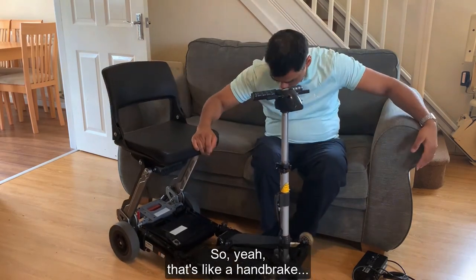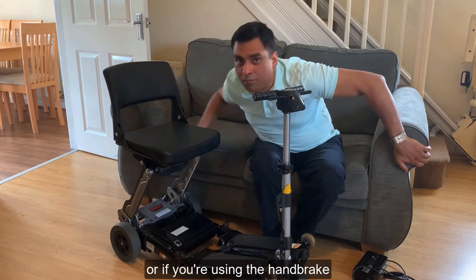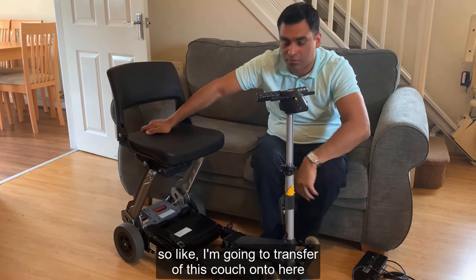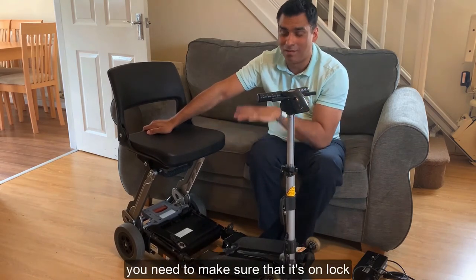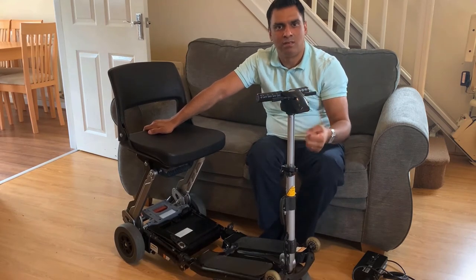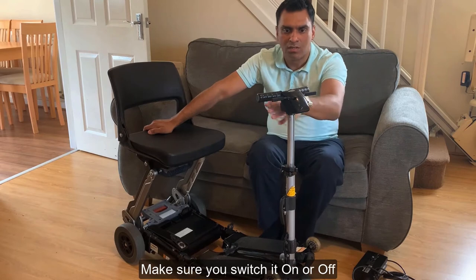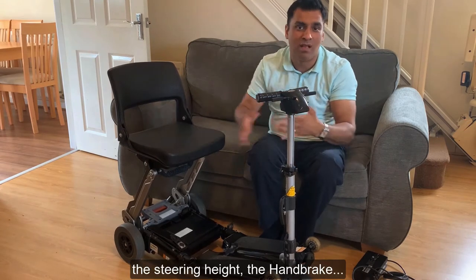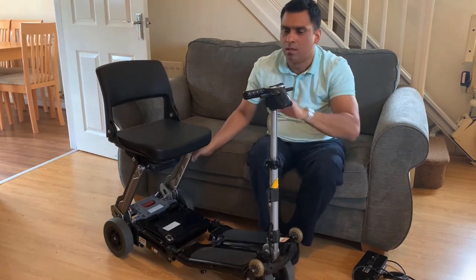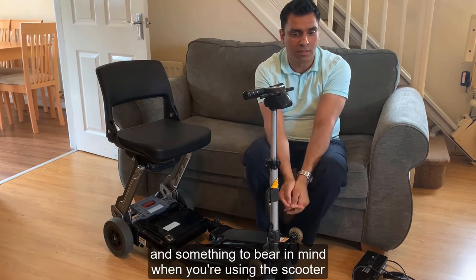One important thing to remember with the handbrake: if someone's helped you move the scooter using it, make sure you switch it back to locked afterward. If you're going to transfer off a couch onto the scooter, the last thing you want is to leave the handbrake off and slide away. It's like parking a car - handbrake on, keys out. Make sure you've checked the steering height and handbrake are set correctly before use.